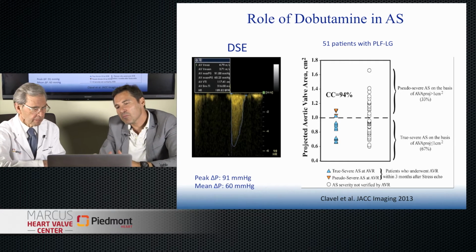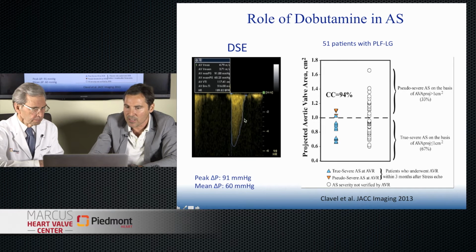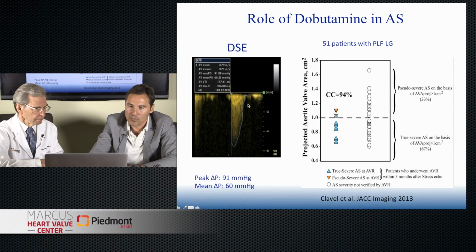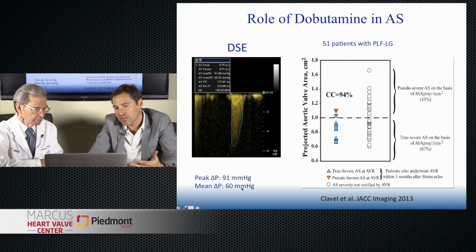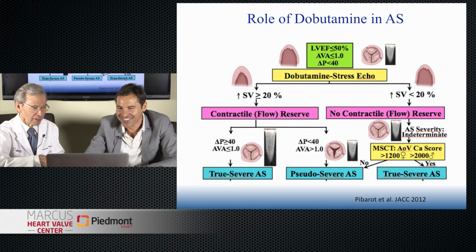And this is maybe a small study coming from the group of Philippe Pibarot, and this is the case that we had, showing that with dobutamine you can have a significant increase in mean pressure gradient. But I would be very cautious using dobutamine stress echo in patients with low flow, low gradient, because the ventricle is so remodeled that you can get some LV obstruction with decreasing blood pressure. Correct. It could be dangerous. So very cautious. Low dose. Really low dose.